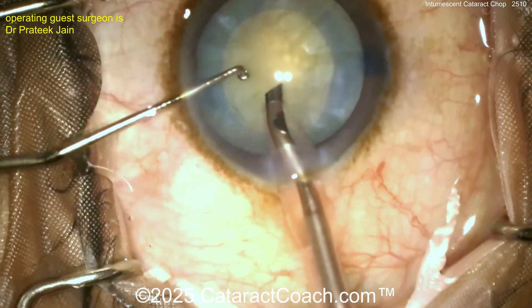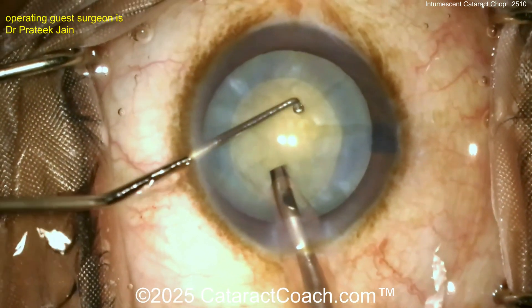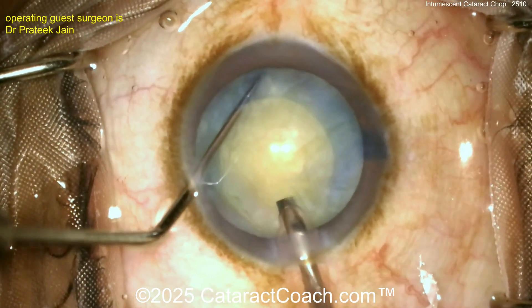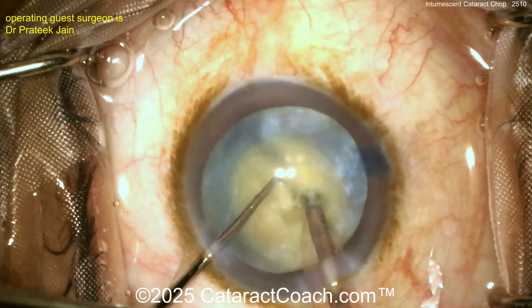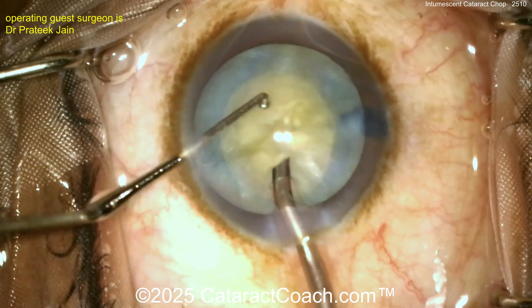Now coming in here with the faco probe — here comes a chopper on the other hand, a ball-tip chopper. So probably a horizontal chop technique here. The chopper is going around the equator, spinning the nucleus around. Now buzz with the faco probe — and there's a nice chop propagating through. Rotate a little bit, chop again.